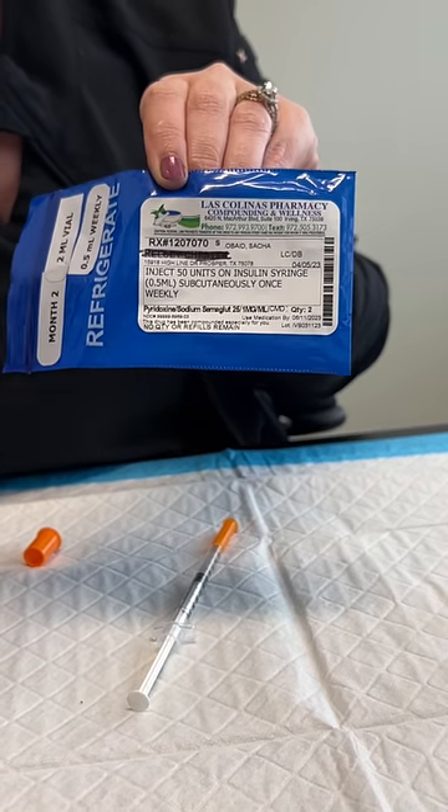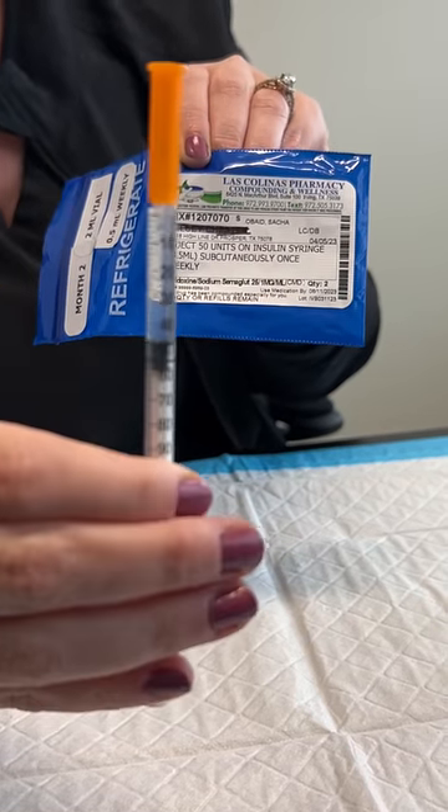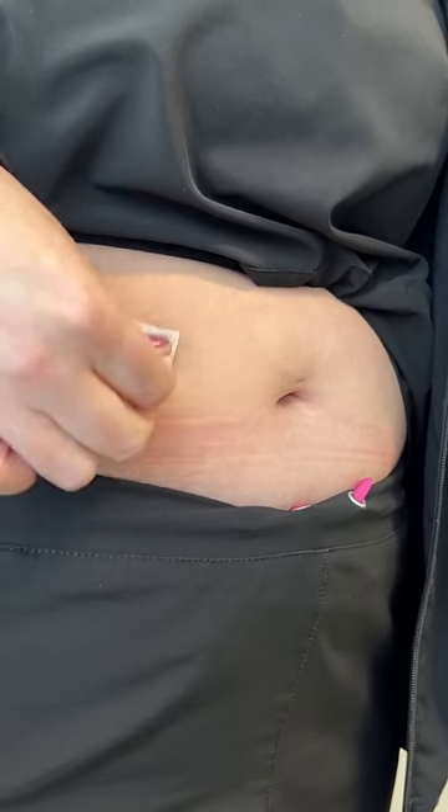Remember again with the dosing instructions, this is going to vary. You have to look at your blue bag and see how many units it's telling you to inject. If you're using an insulin syringe, it's very straightforward as to how many units you should inject.